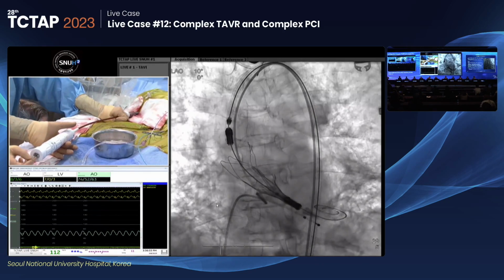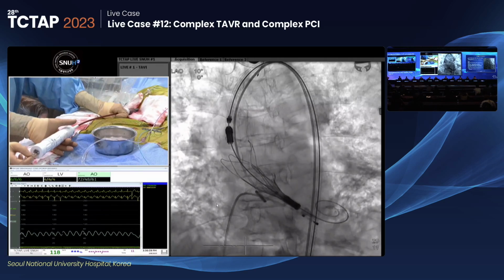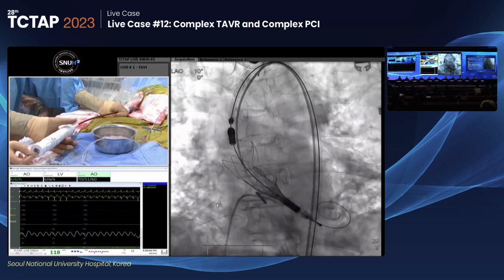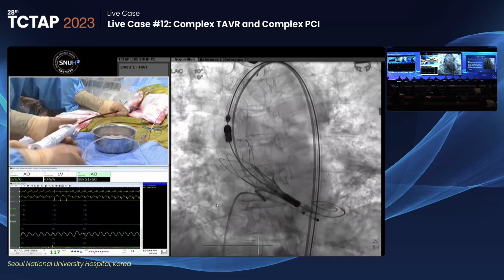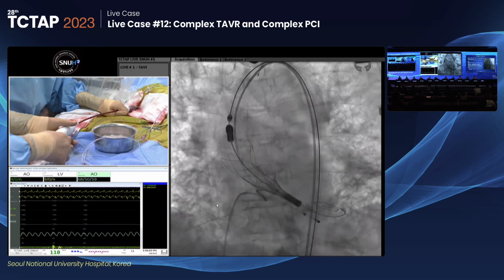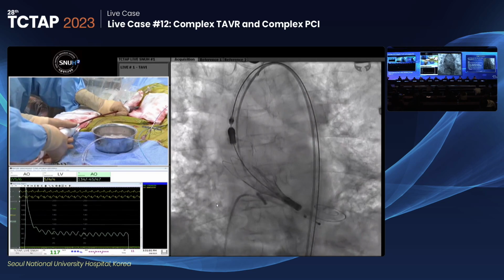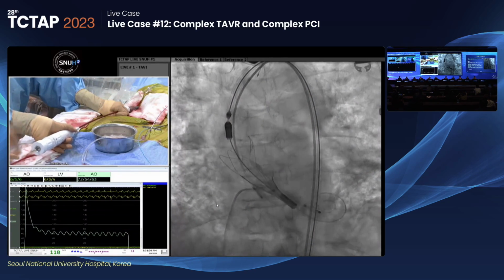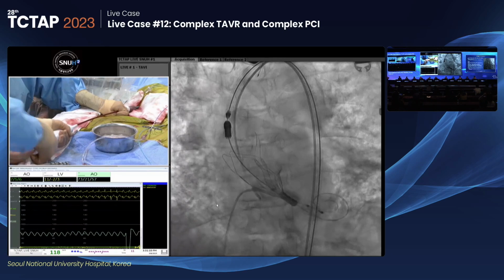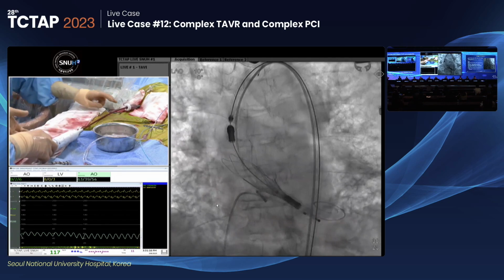Thus, theoretically, the device should be fixed. But in my experience, during the third deployment process, the device will move upside or downside. We cannot predict it, but the movement is very little. And this part now is fairly quick. A little bit there, but I can start the deployment. I can do a rapid deployment. Deploy, rapid. Bingo. Okay.